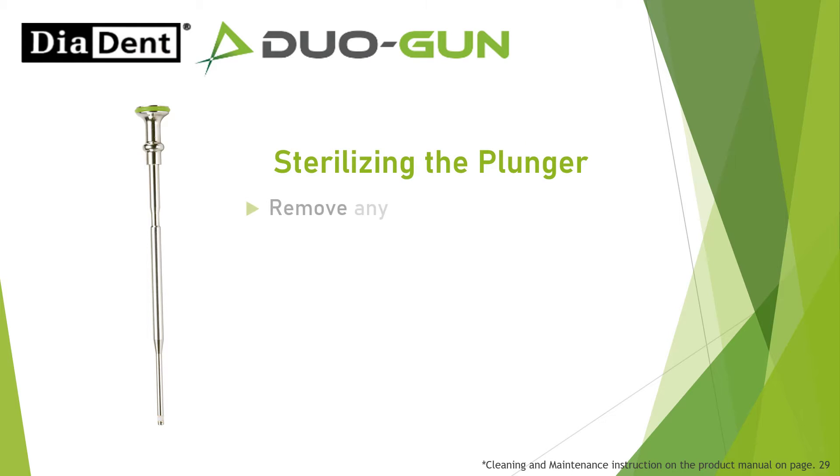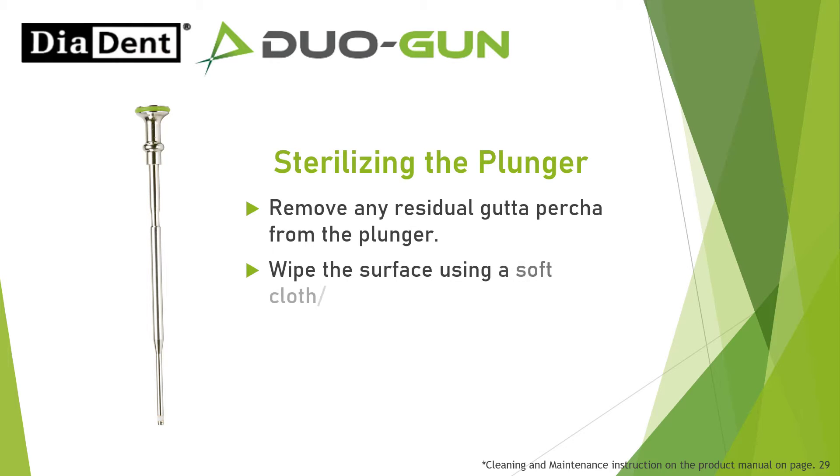Sterilizing the plunger: Remove any residual gutta-percha from the plunger. Wipe the surface using a soft cloth or cotton pad soaked with alcohol.